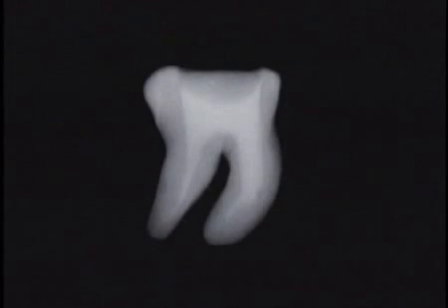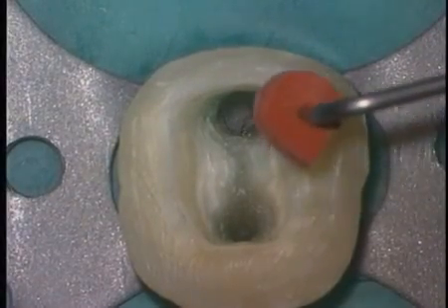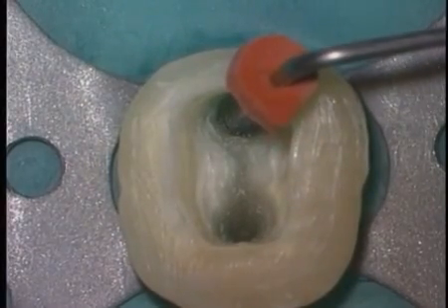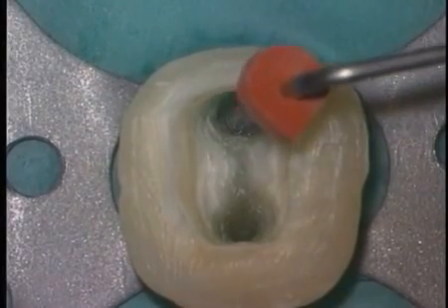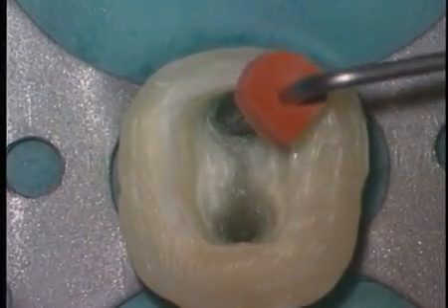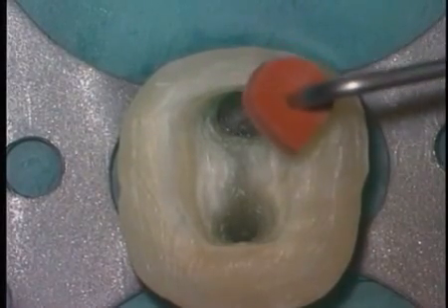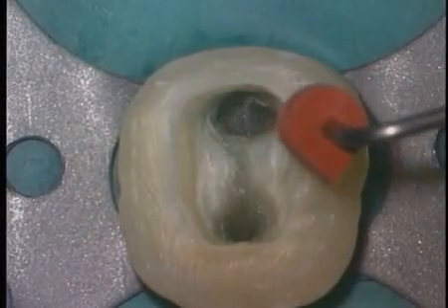In this extracted mandibular molar, we have injected a radiopaque contrast solution to clearly demonstrate a large Type 2 ledge. When working deep subcrestally in cases that are ledged, Dentsply MyFair has brought us an instrument called micro-openers. Micro-openers only have about 5 millimeters of cutting flutes, and their double tapers provides enough rigidity that we can begin to pick into the true pathway of the physiologic canal.